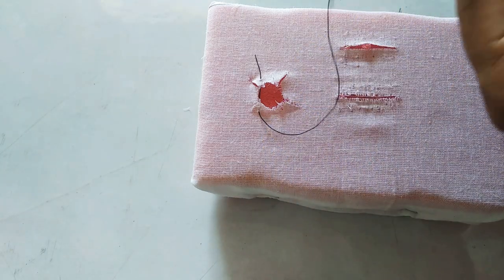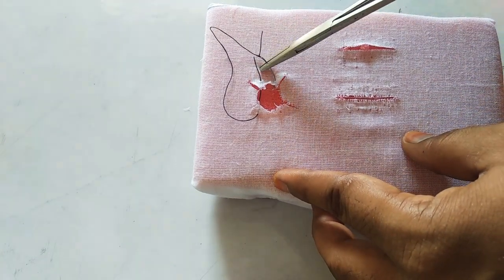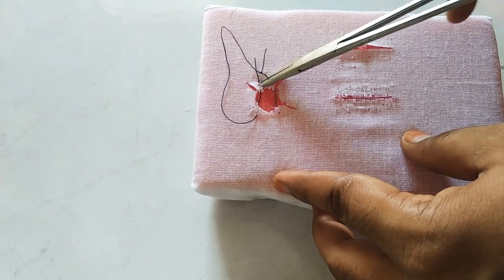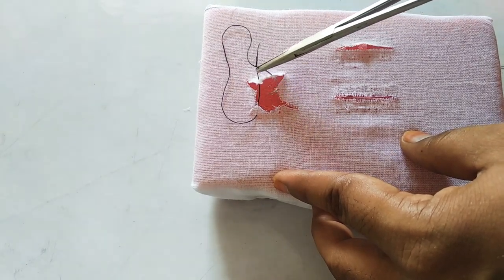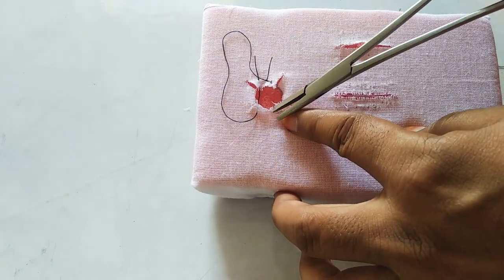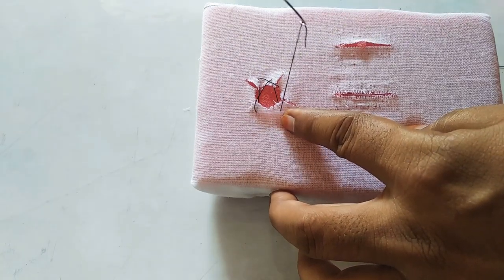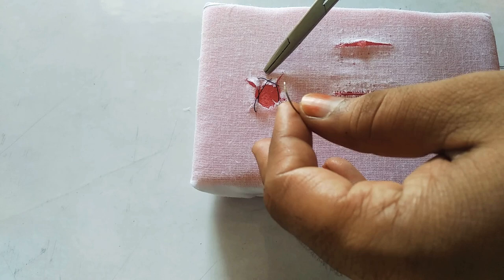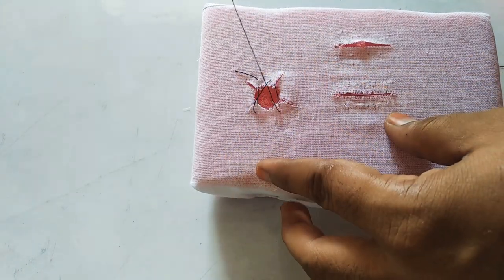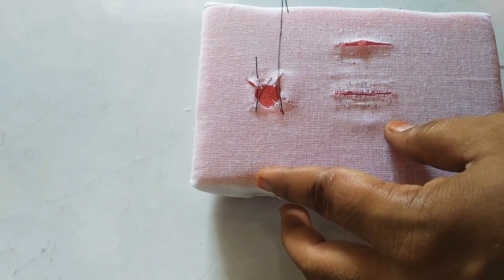Then engage the distal papilla on the buccal side, like this. Again you come to the lingual side to engage the distal papilla on the lingual side, like this. After this, you come back onto the buccal side to the mesial interdental papilla. This is the long end.